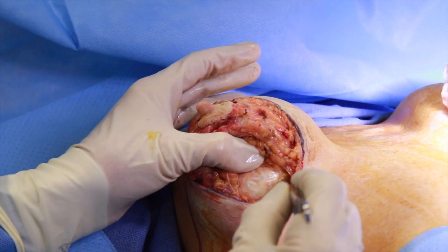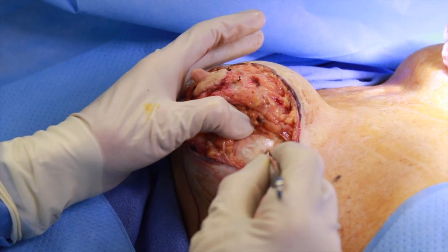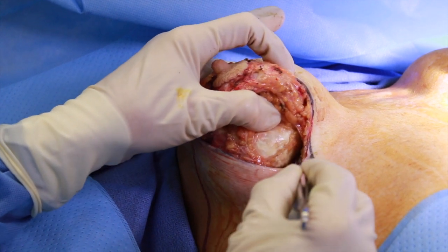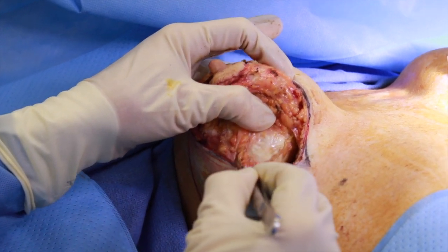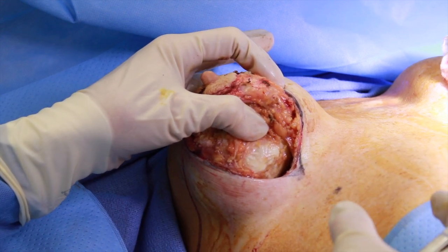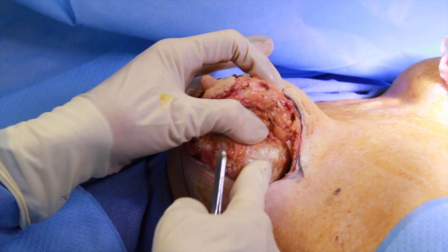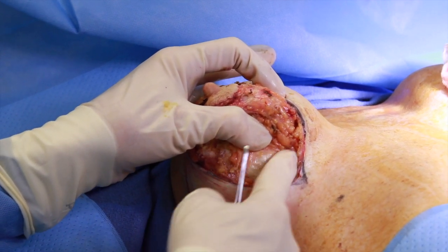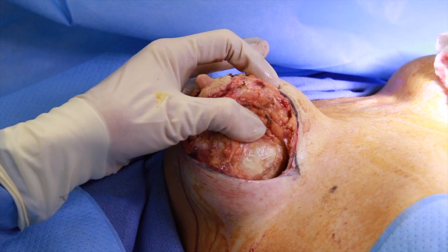We have made the incision at the bottom down to the implant. You can see this is all scar tissue and it's going to be very difficult to dissect, but we're going to dissect all the way around this ball and try to get this scar tissue to come out in one piece because I can feel it's very, very calcified. There are going to be a lot of sharp little fragments in there.